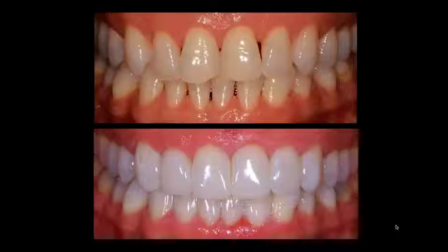So let's start with this case. On the top photograph, what you see is a preoperative presentation. And the patient had several aesthetic concerns. She did not like the open gingival embrasures. She wanted to brighten the color. She didn't like the jagged, harsh incisal embrasures, and then she had some chipped incisal edges.